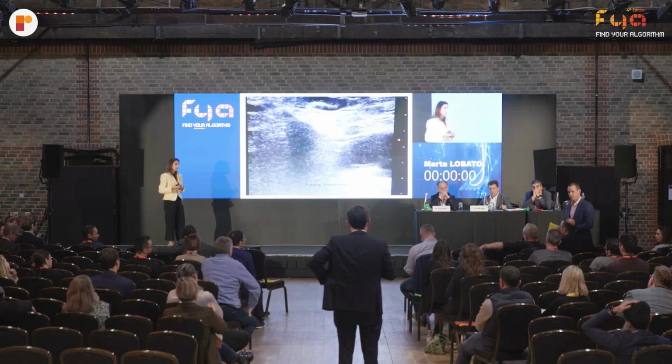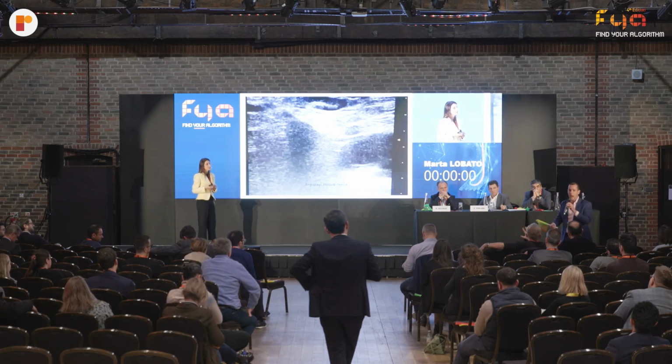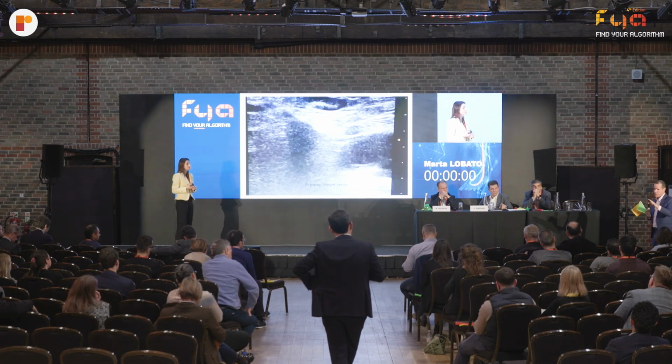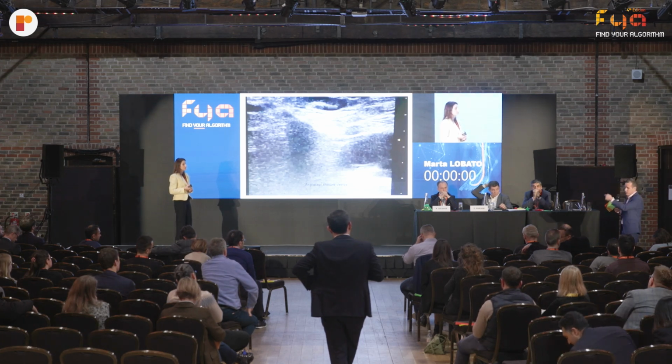Isn't it in real life such that we should always try to achieve the best flow possible? But what limits us is if the patient doesn't tolerate a longer procedure, or if we fear that by adding another vessel, we jeopardize what we already have achieved. How would you have jeopardized what we have achieved? Not in this case. Yes, of course. This was my comment before with Mariano, this kind of going transcollateral. Yeah, this is very dangerous. What's the risk? Almost close to zero. Sorry, you can start the video again.